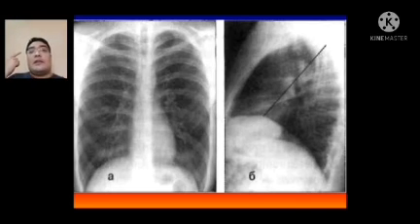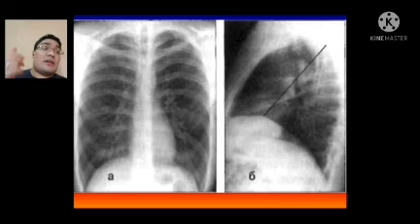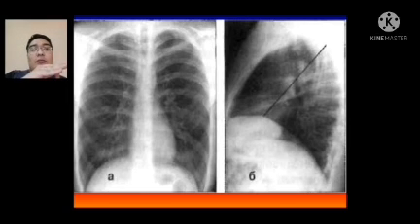So, what are the benefits of this method? It's fast, and it gives a lot of information not only about the lungs but also about the heart, the bronchi, the bones, and other organs of the chest cavity, for example the diaphragm and the pleura. Most methods need to be made in two projections. Why? Because sometimes in the front projection we cannot clearly visualize the pathology compared to the side projection, and the opposite. So at least two projections are preferable.